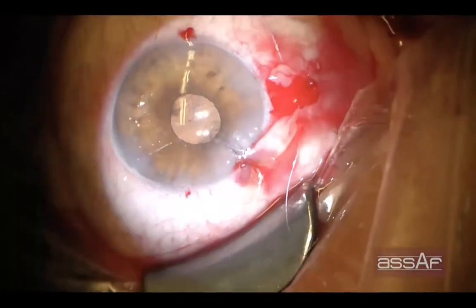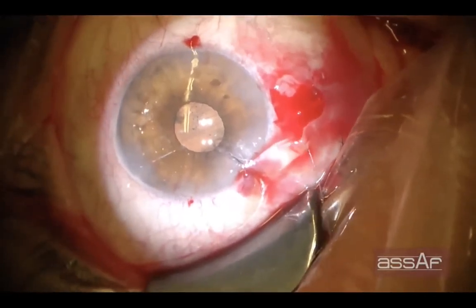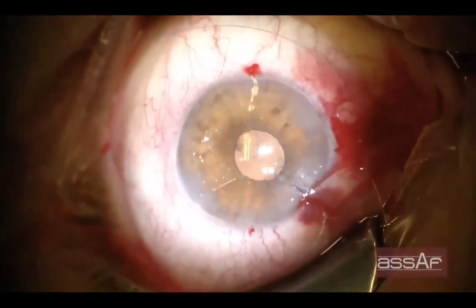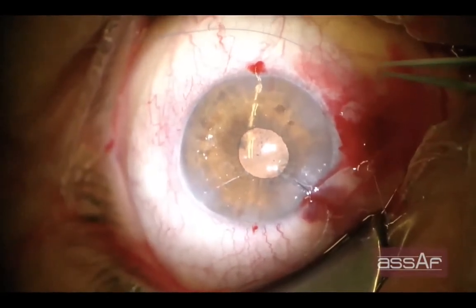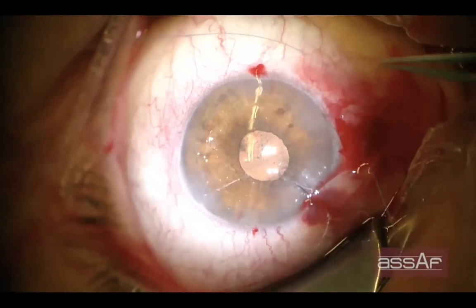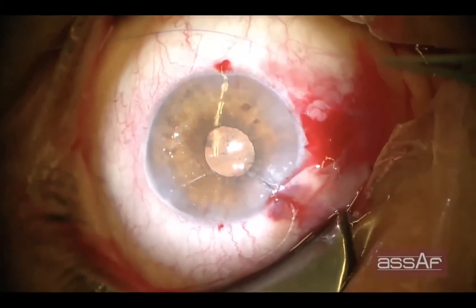And now I'm closing the conjunctiva after closure of the sclerotomy with the Vicryl 8-0, and one safety suture of 10-0 nylon suture to the main incision, to be removed 1 or 2 days after the procedure.